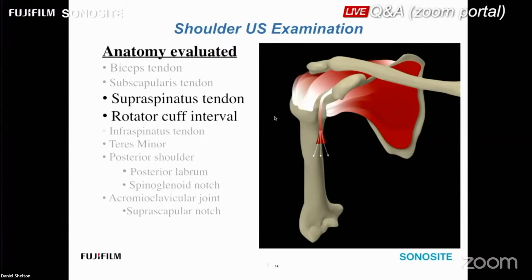But you're going to see a lot of diagrams. You're going to see a lot of anatomy and ultrasound images depicted in here. I'm not going to read from the slides. I'm going to breeze through these slides as quickly as I know how to, but just know that this is recorded and you can go back through the recording and pause these videos as a diagram for you to scan along. I encourage that. You go through these slides, you hit the pause button, and you try to achieve the scanning targets that are discussed in each slide, and that will be a very nice scan along.